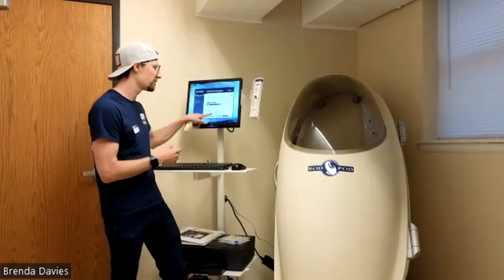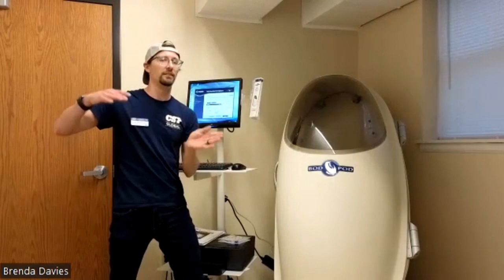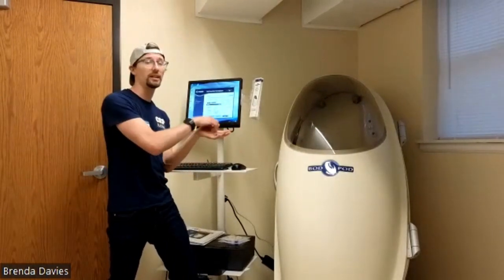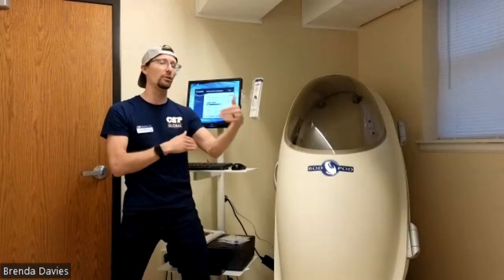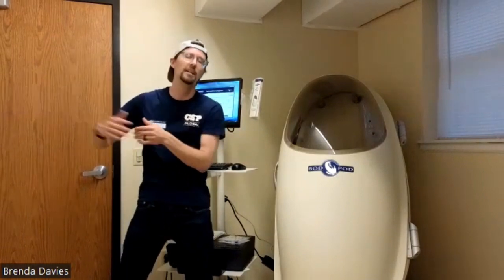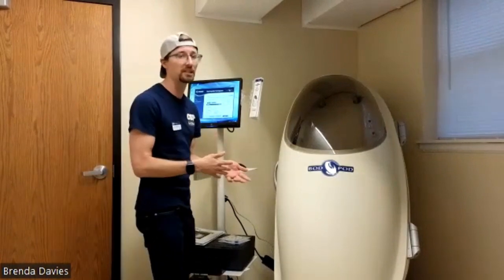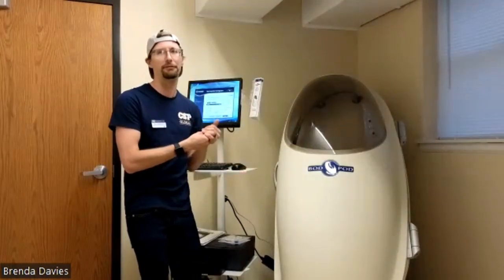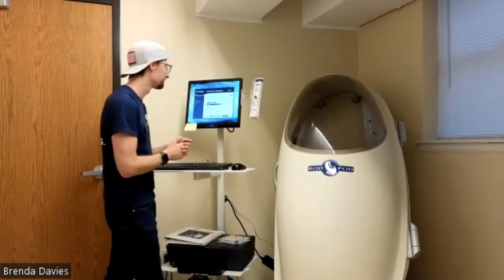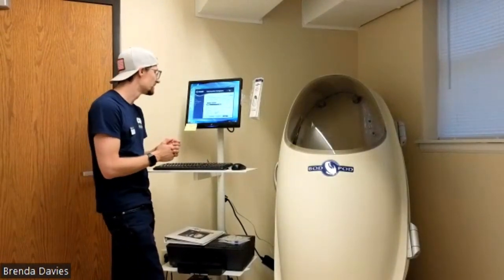This is an estimate. It's not necessarily specific to Anna for that total daily energy expenditure. So how I would use this information is I take the estimated resting metabolic rate and then have Anna measure the activity that she's doing throughout a couple of days, take an average of that, and add that to the resting metabolic rate to give you a closer, more specific energy intake that you should be hitting, because here's how active you've been. So this is a good start to get you close, but if you wanted to make that a little more specific to the client, you want to really do a self diary calculation on the activity that you're doing throughout the day. That's basically that.